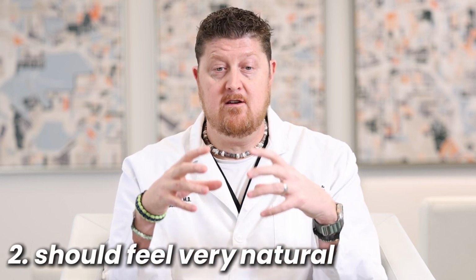A properly fitting and properly made set of dentures should feel very natural. It should feel like a natural extension of your mouth and your gums. When you're chewing and talking, you shouldn't have to worry, oh my gosh, my teeth are going to flop out, or oh my goodness, I'm going to bite my cheek, I'm going to bite my tongue. These are all things of an improperly fitting denture. A natural denture allows you to chew and function and focus on everything else you're doing, and not spend all your energy and intensity on just how those plastic pieces come together.